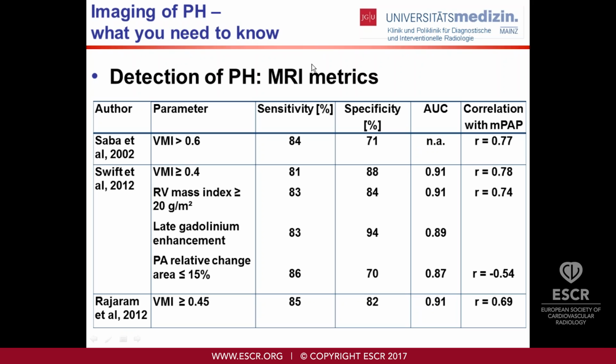And in this patient, you again have an excessive dilatation of the main pulmonary artery. And of course, due to the increase in pressure of the right heart, you have a backflow, a reflux of contrast in the liver veins to a degree that is not normal. Again, this is a hint. If you just take a look below the diaphragm, you can see, well, this patient must suffer from pulmonary hypertension. And this is also true if you take just MR metrics from cine imaging.